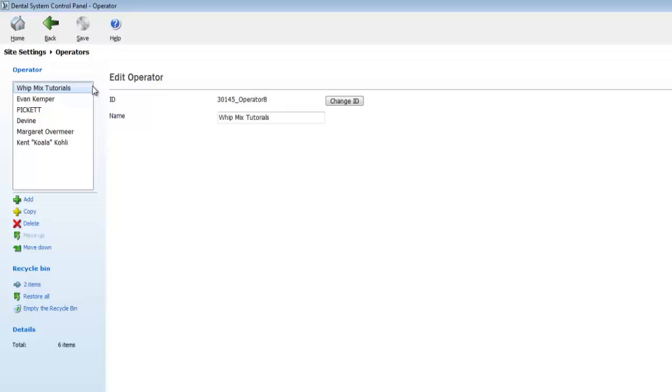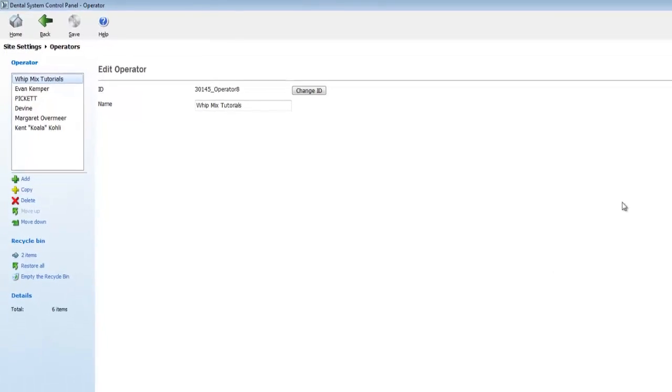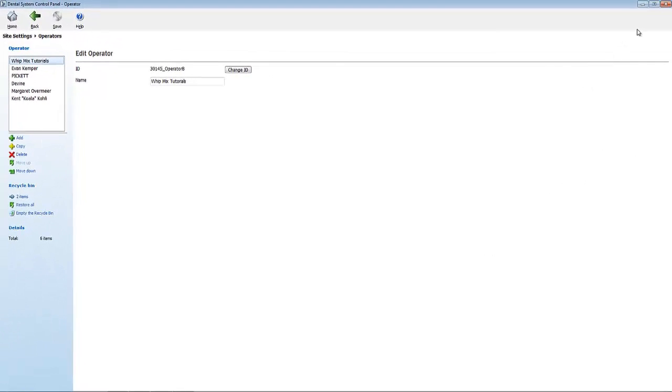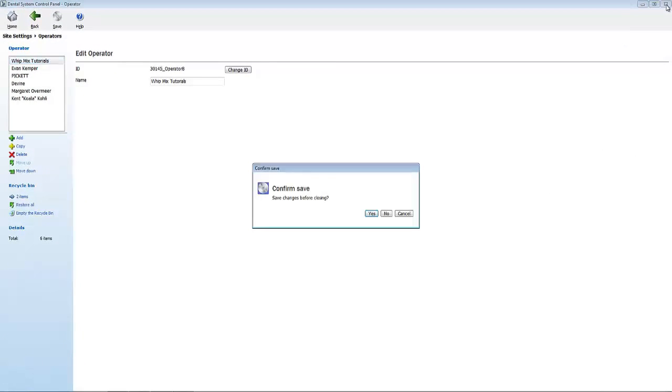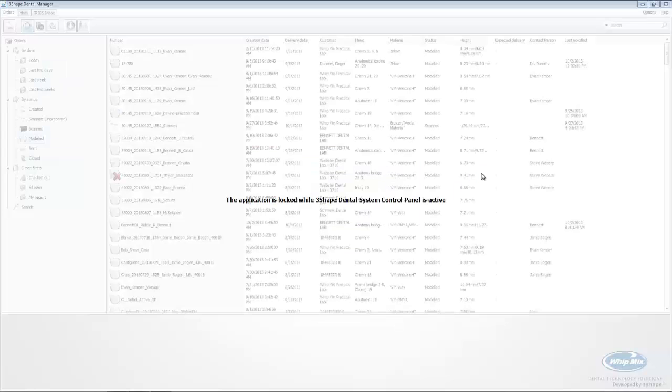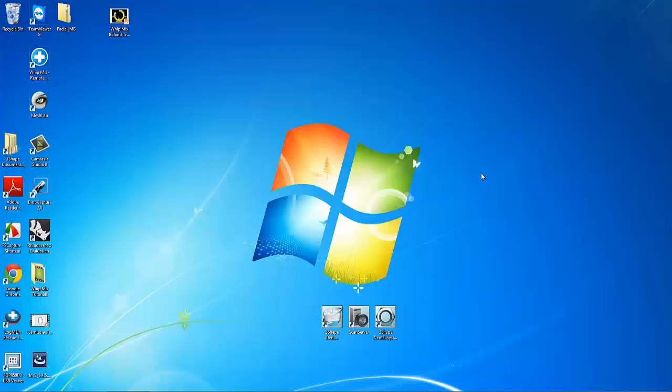We do this by clicking the X at the top right hand corner of the screen. When we click the X, it will ask us to save. And then it will close the window and restart dental manager with the changes we just made.